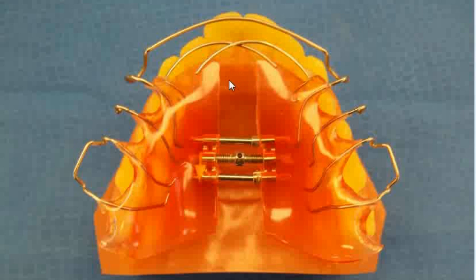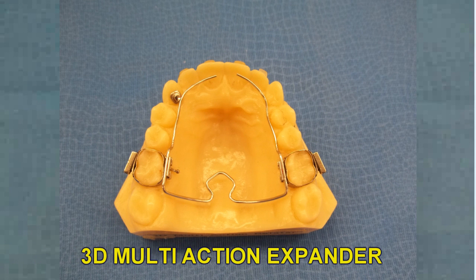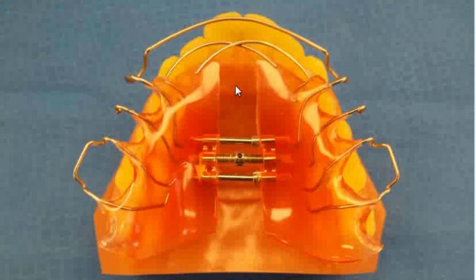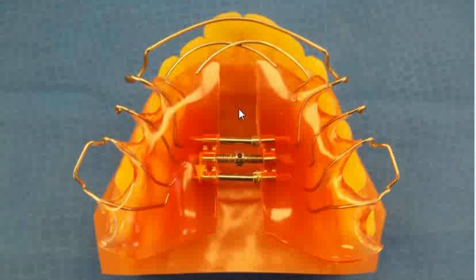Once the expansion is completed, you'll need to retain the expansion for at least 4 to 6 months. You can use the Schwartz as the retainer or switch to a fixed holding appliance such as the 3D multi-action appliance. The fixed holding appliance will allow you to begin straight wire treatment immediately after the expansion is completed. If you're going to have the patient wear the Schwartz as a retainer, it's important to fill in the space between the 2 pieces of acrylic with more acrylic. This will stabilize the appliance and reduce the possibility of breakage.